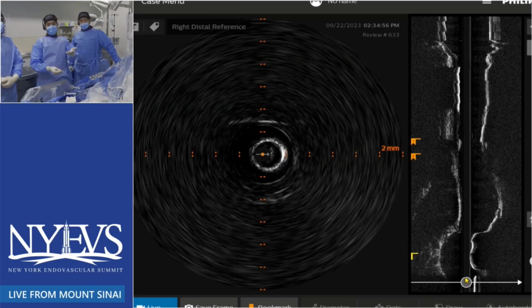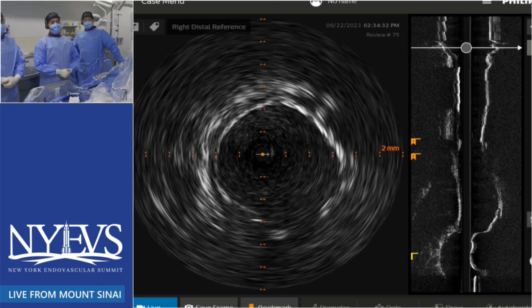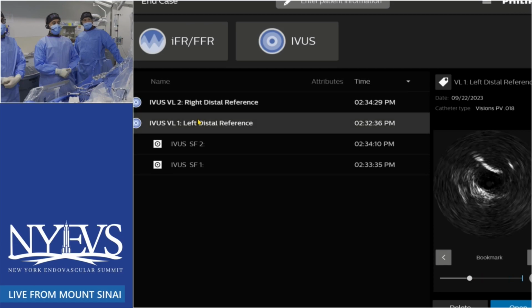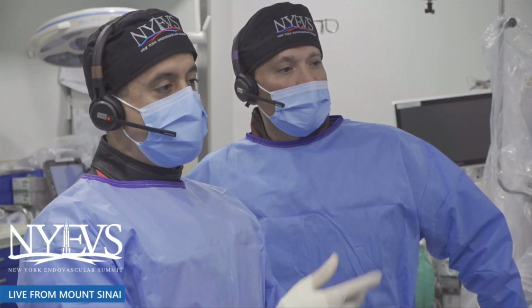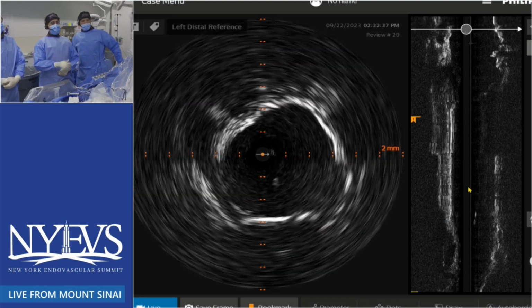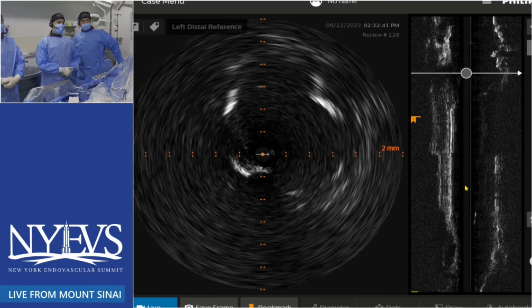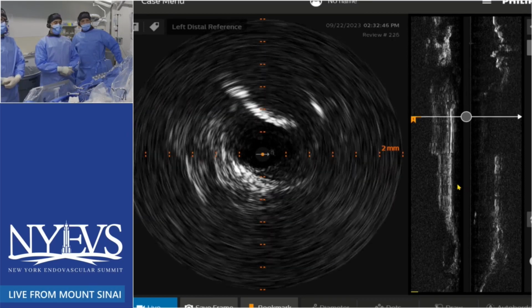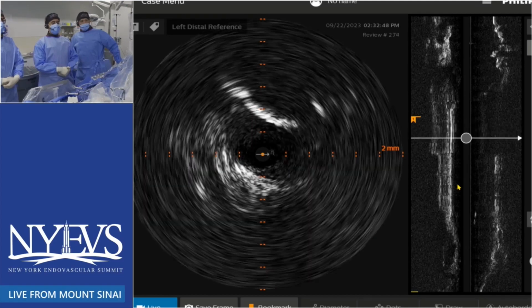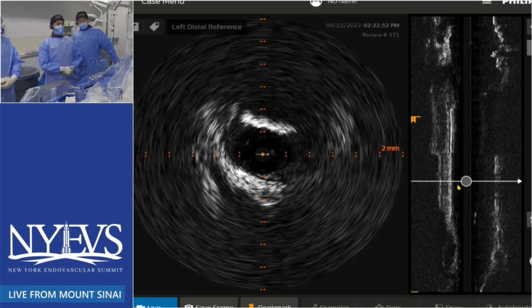So we'll look at the IVUS, and then we'll get the panel's thoughts again on whether they want to revisit the idea of doing a shockwave, or still hold true to their first commitment of just straight up covered or non-covered without shockwave. This is the right side now, again starting in the distal aorta, like Karthik said. And just to make things interesting, Vishal, we're going to move to Tennessee after we review the IVUS with Dr. Metzger's case, and then we'll give you time for what you guys plan to do and see the finish.